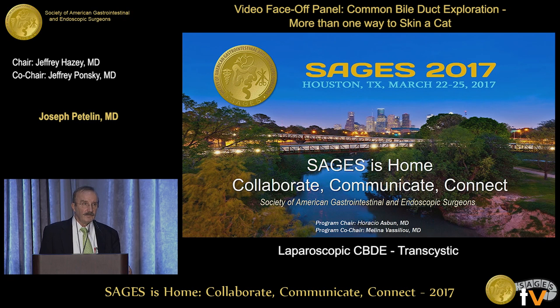So we've moved to, like the gentleman before me had spoken about, using the ERCP endoscopic stents, closing the bile duct over them primarily, whether we do them open or lap. And the big advantage that I see is that, bottom line, the videos you've shown, those are primary bile duct stones, and they will need an internal drainage procedure anyway. So whether or not they have a sphincterotomy later on, I don't think is a major issue. And it helps the ERCPist having a stent in place.